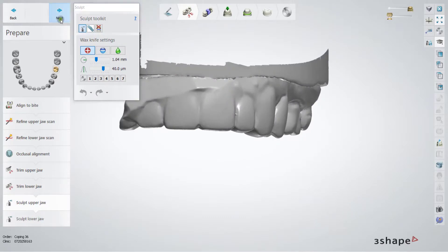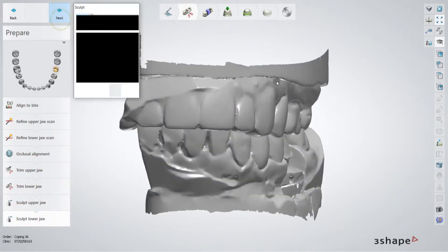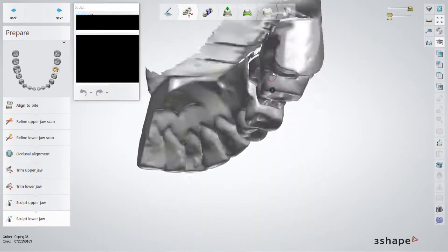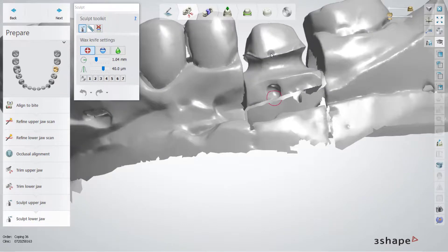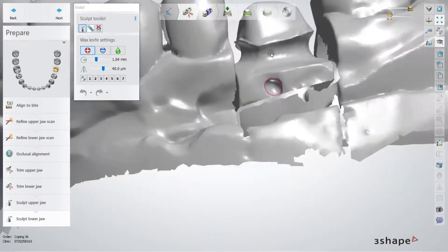And in this part, we can sculpt the upper jaw. I also think it's not necessary.